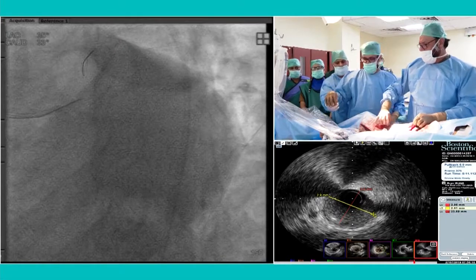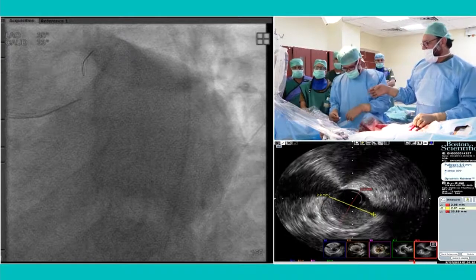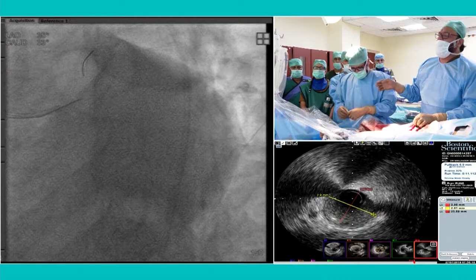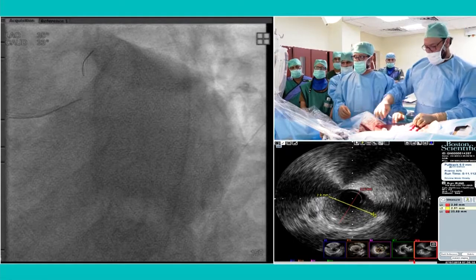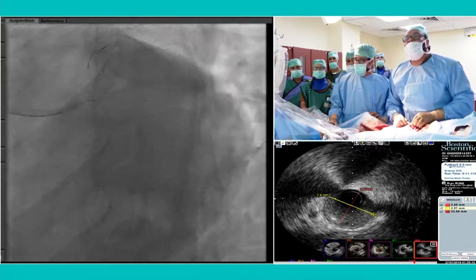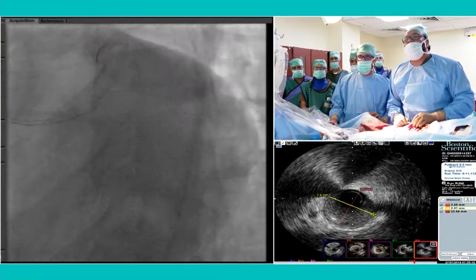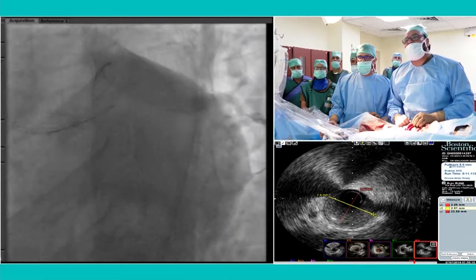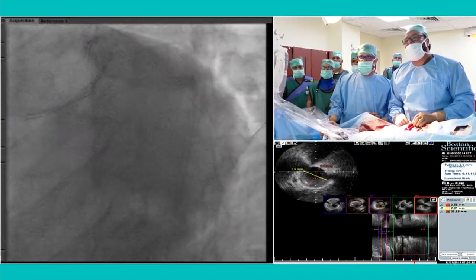So when you have a significant disease, there should be preparation of the ostial lesions, both circumflex and LAD. What is the IVUS? We had seen that there is not much of an issue at the ostium of the circumflex. That's why no pre-dilatation was done.